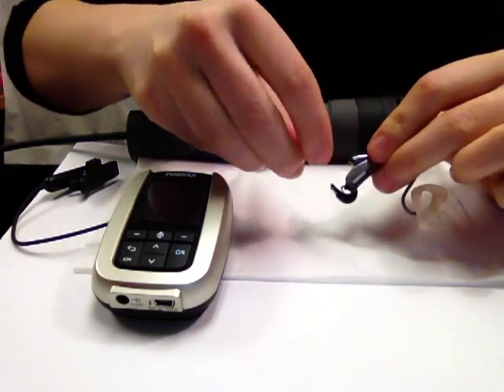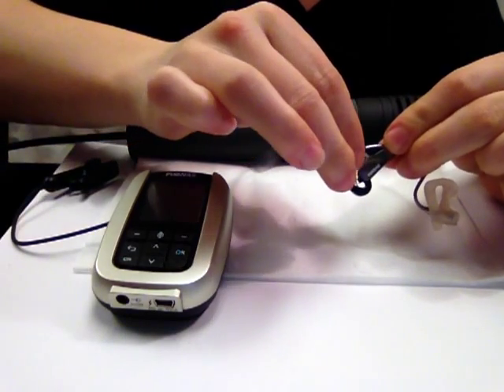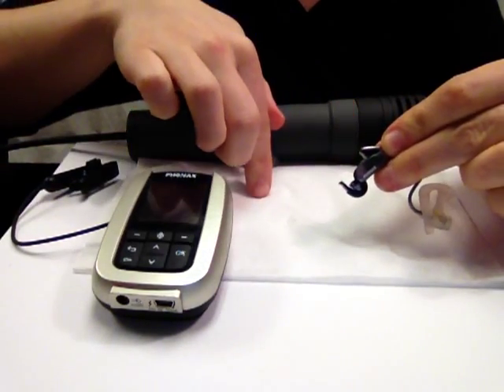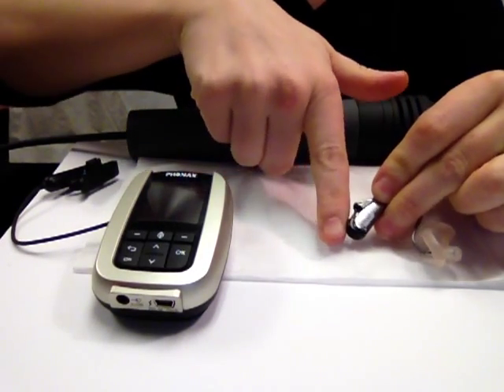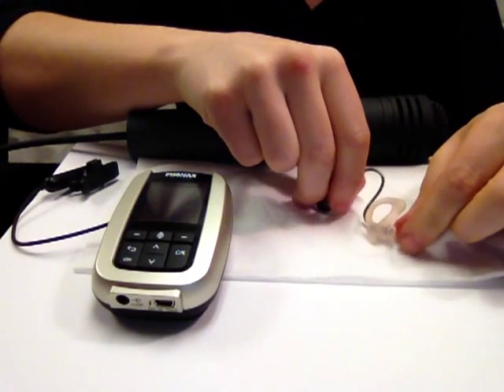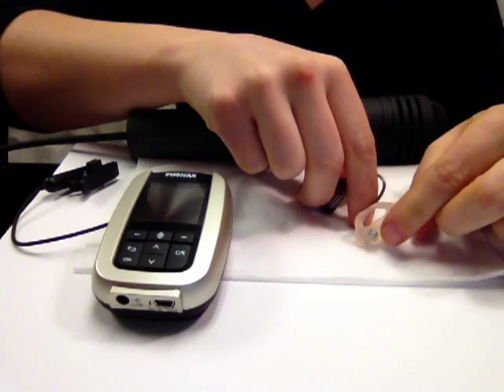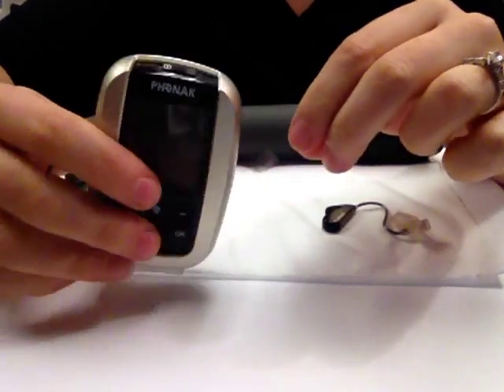Make sure the battery is inserted properly. The ridged edge of the battery should face the side of the iSense receiver that has the Phonak name on it. Close the battery door completely before proceeding. Place the iSense receiver close to your ear. The opening on the ear mold should be toward your ear, and listen as you turn on the iSense transmitter.